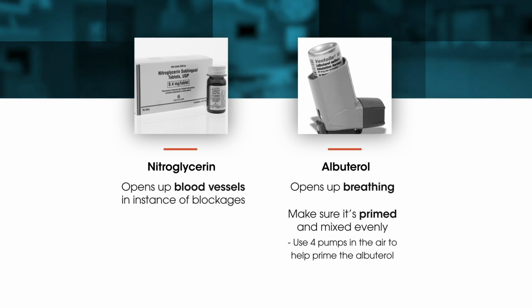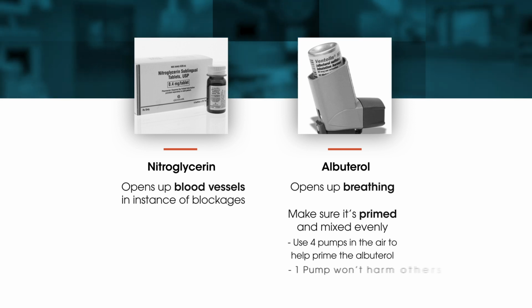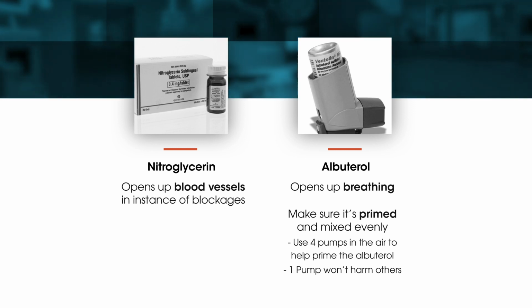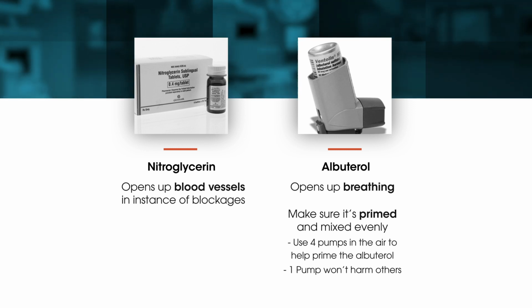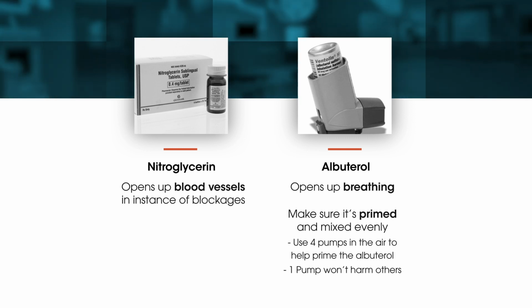Albuterol, I am an anxious person, so I'm letting you know that albuterol is okay if you breathe it in accidentally. So if I squirt some pumps of albuterol out here, nothing's going to happen to me or anybody else around. So that's okay to do. So you'd squirt a few pumps, you'd shake it up, and then you'd follow the instructions for albuterol to give the person that. But ideally you want the person to bring their own.